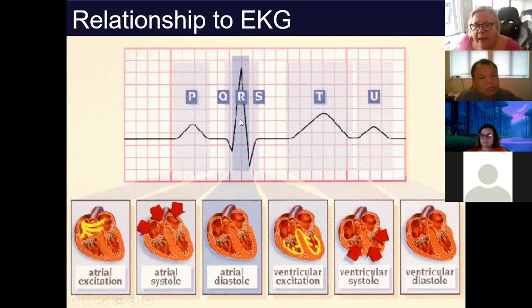The R wave, again, is measured from the bottom to this bottom. And this is why all systems now have electronic calipers. But if you run a tape and take it as a hard copy, you need calipers. I meant to get my calipers to show you.